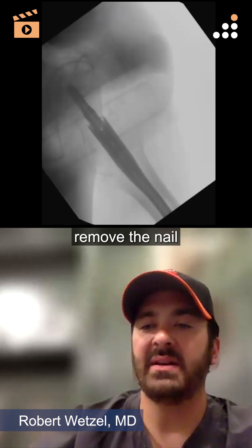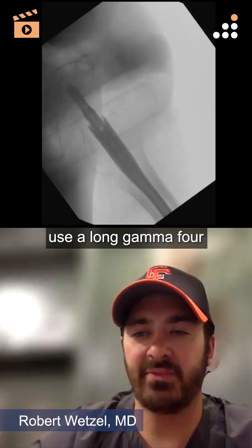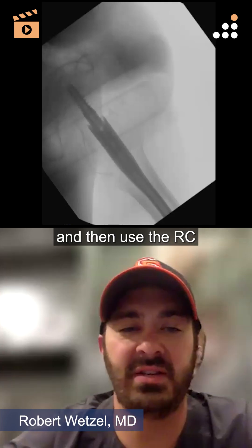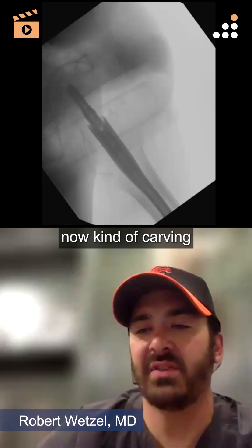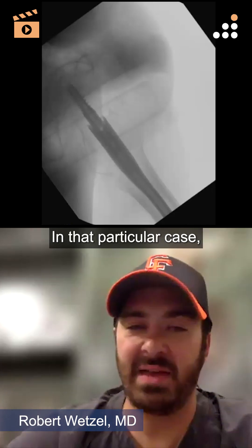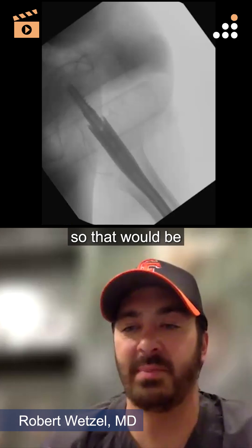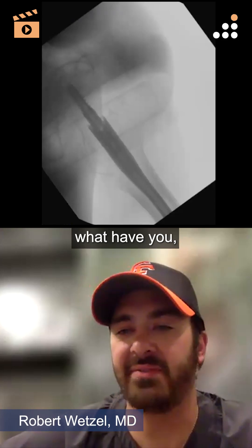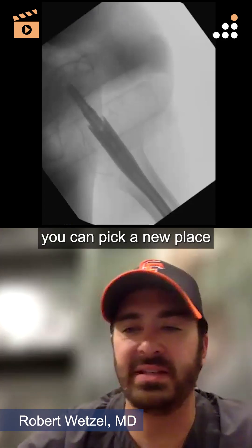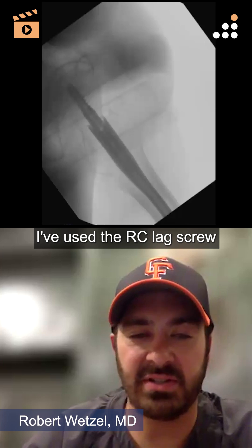Because it was a previous blade that was in, I removed the blade, removed the nail, got an anatomic reduction, put a long cephalomedullary nail — a long Gamma 4 — and then used the RC lag screw to literally do what the name implies, carving into a previous path already placed. In that case, the previous blade was actually in a good center-center position, which was my desired placement. In a revision setting, if you get lucky you can pick a new place for clean fresh bone as long as it's safe for the overall fixation pattern.